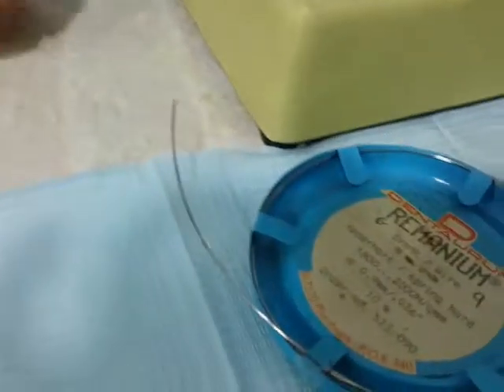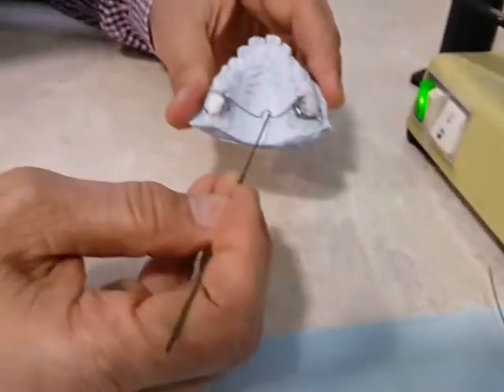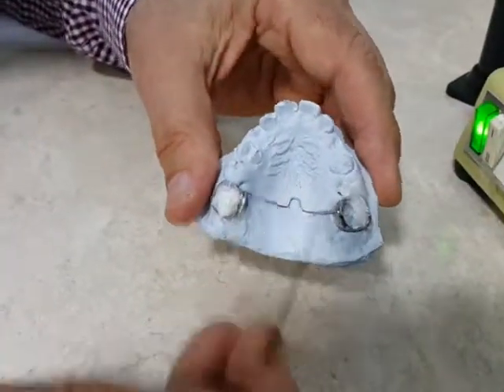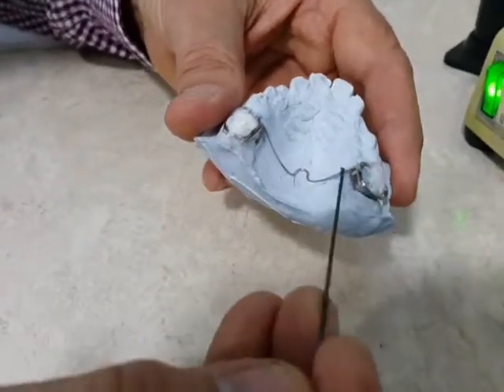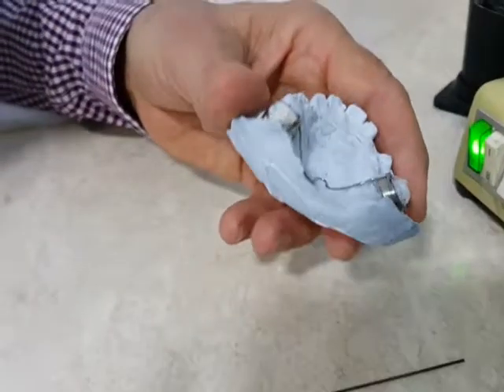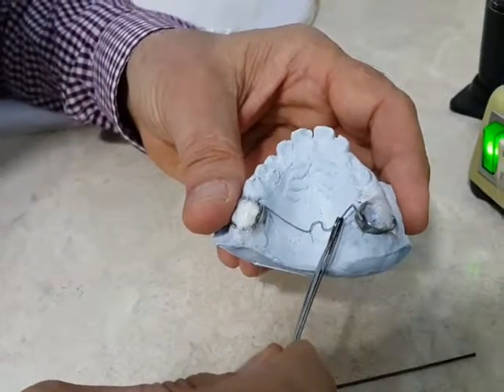We constructed the palatal arch in between the two molars and we put a little u-loop for adjustment in the future. Now, to get good attachment on the molar region, we do two more procedures: welding and soldering. As you can see, the palatal arch is movable now.